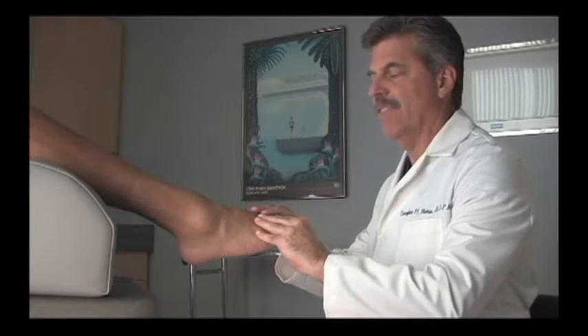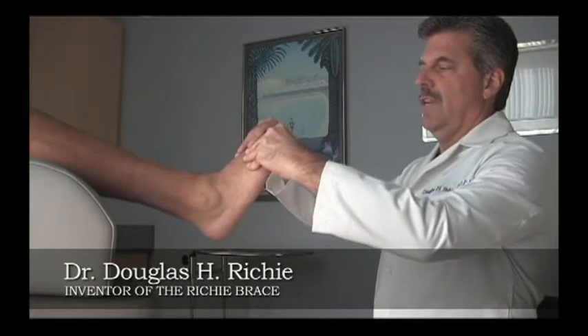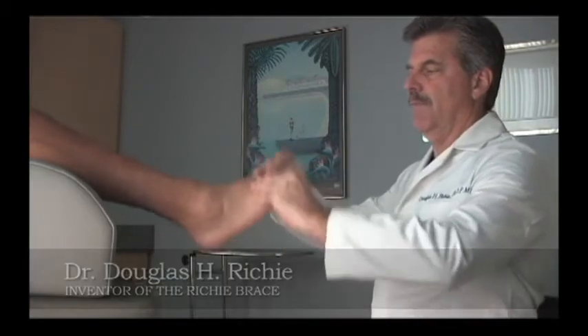We're going to demonstrate a patient with a flaccid drop foot who is an excellent candidate for the Ritchie Dynamic Assist Brace. The criteria for that particular brace is the fact that the patient has a flaccid drop foot.